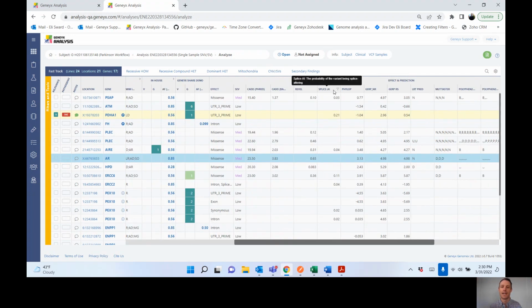So at a high level, SpliceAI predicts the probability of a variant being splice altering. And so really what this does is it predicts the splice site junctions from a pre-mRNA transcript, which enables precise prediction of non-coding genetic variants on cryptic splice sites. So this will ultimately allow you to look at splice site variants that occur in maybe intronic or deep intronic regions, and ultimately identify maybe previously overlooked non-coding genetic variants in the human genome for patients with rare diseases.